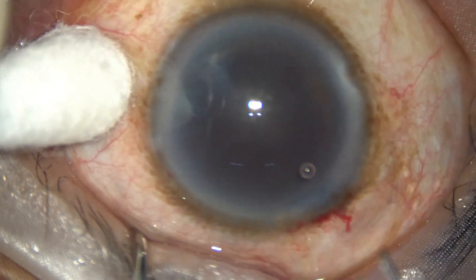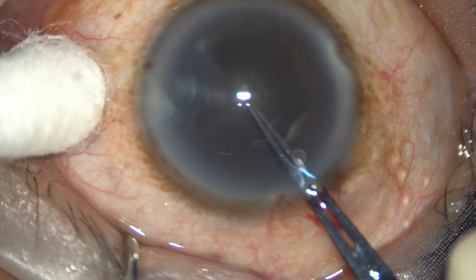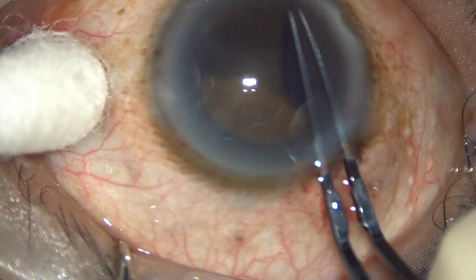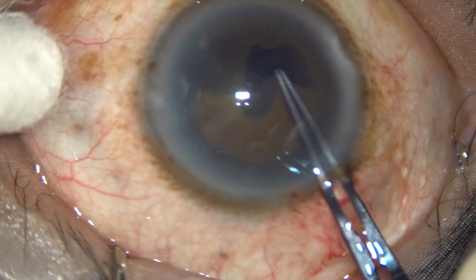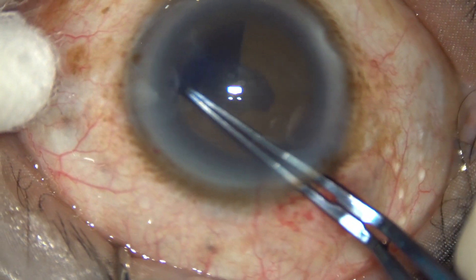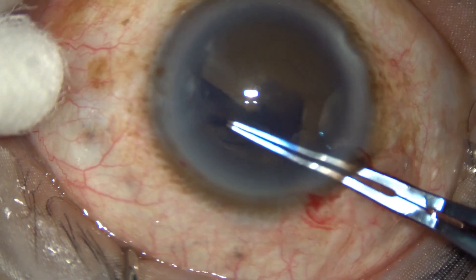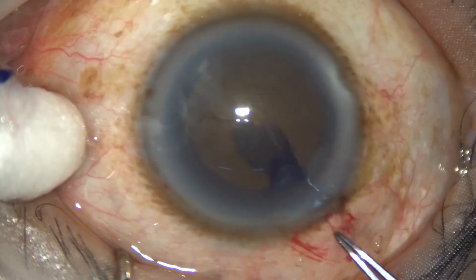In this video we are going to see management of hard cataract. After the initial steps, capsulorhexis is being done with utrata forceps. With the tip of the forceps, a central puncture is made. The forceps goes to the three o'clock side and a capsular tag is raised. This capsular tag is guided anti-clockwise all around to get an adequate size rhexis of about six millimeters. In hard cataracts, the size of the rhexis should not be less than 5.5 millimeters.